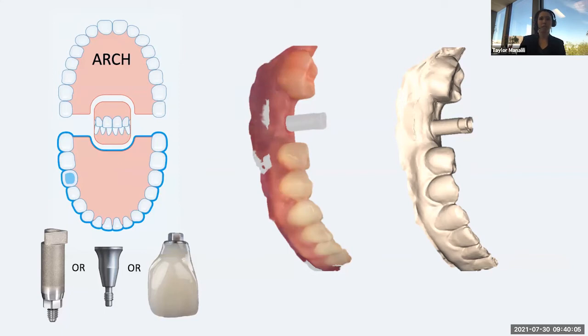But you can see here, you could see it better in the color mode, I actually put in the healing abutment at this point and scanned through. So that's why that scan body looks a little ghostly in the color mode, because it's not actually there. It's just picking up on the fact that it was there during the prep scan and nicely merging those two together.